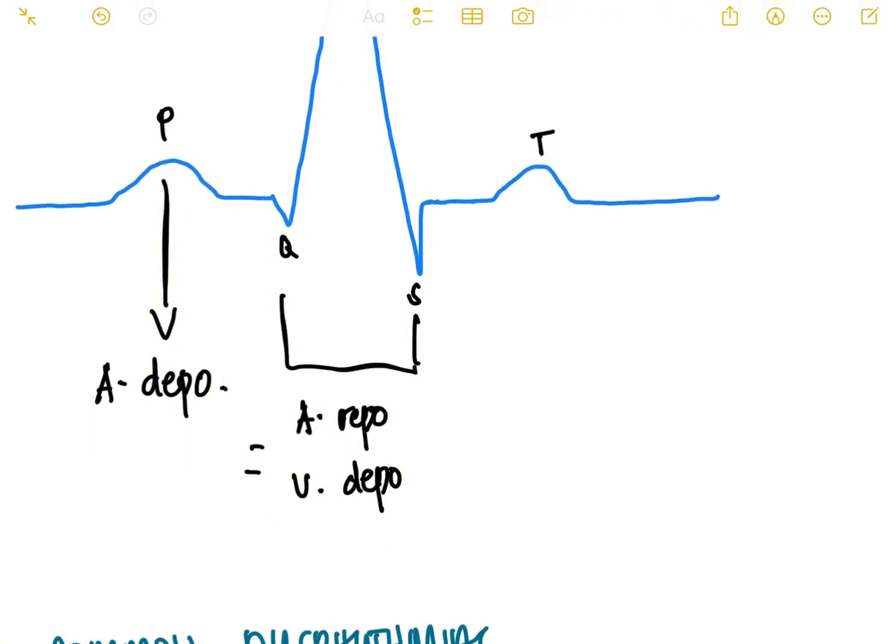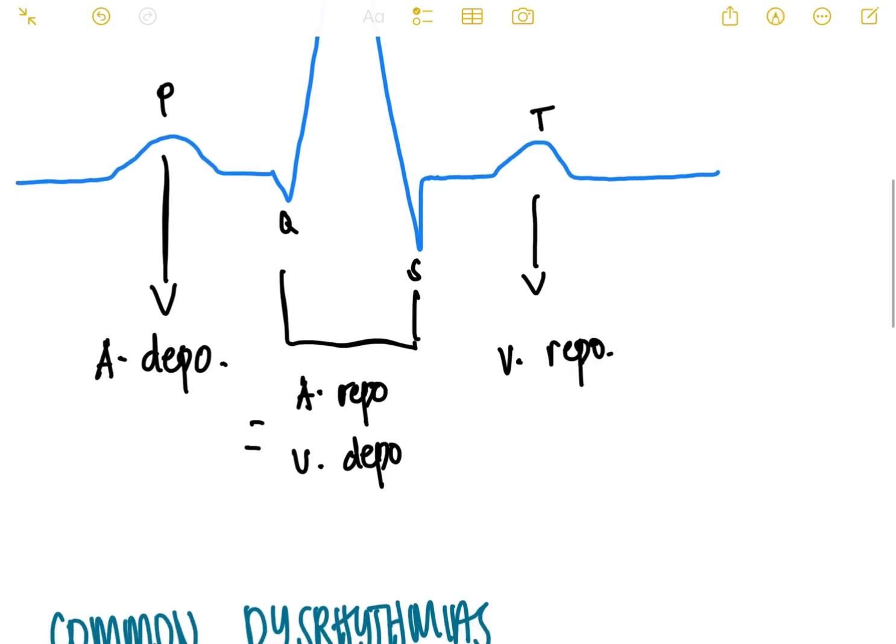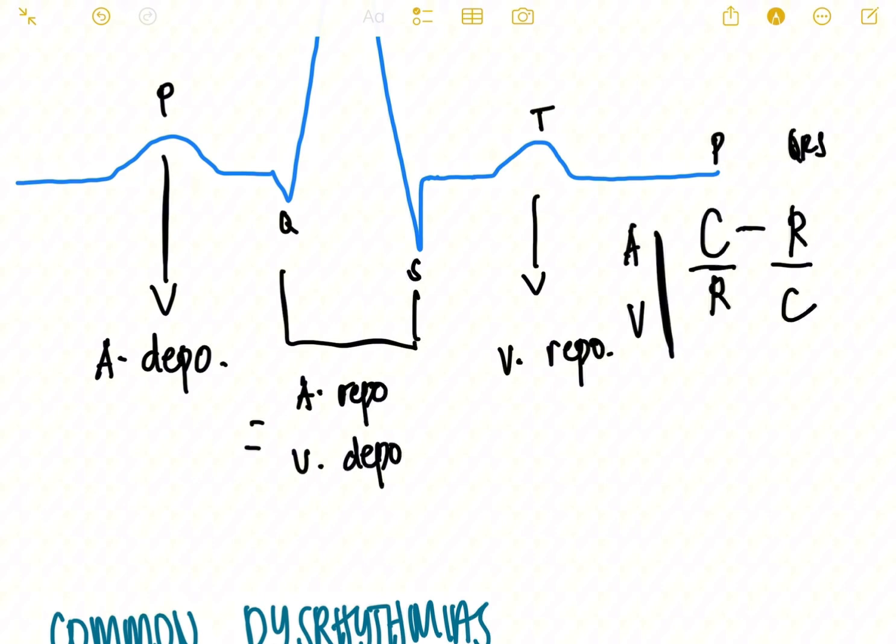And then of course, your T wave or your ST segment, this represents ventricular repolarization or basically the relaxation of the ventricle. So what happens here is, okay, contract, that's your P wave. So in here, for example, ito yung heart natin. Si atria sa taas, si ventricle sa baba. Okay? So during P wave, contract sa taas, relax sa baba. During QRS, relax naman si atria, contract naman si ventricle. And then during T wave, naka-relax na silang dalawa. So yun lang yun, okay?